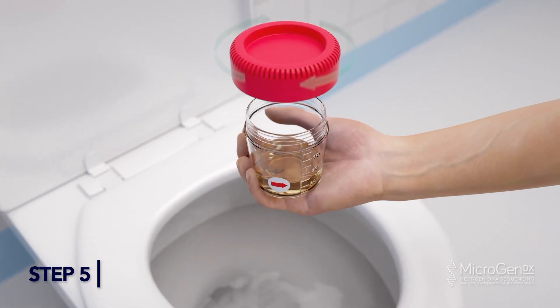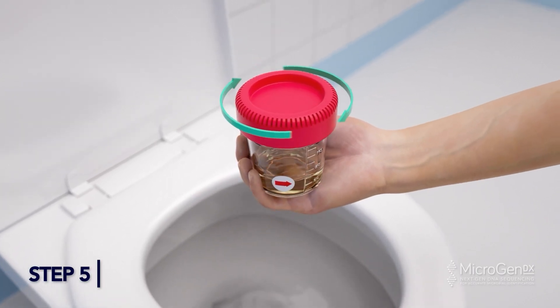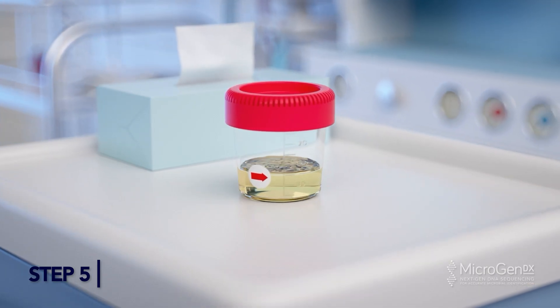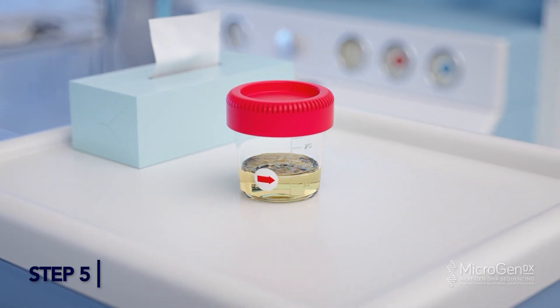Step 5: Secure the lid tightly by placing the lid directly on the cup and turning until you hear two clicks. This indicates the cup is locked.